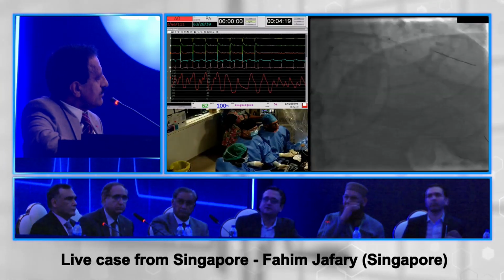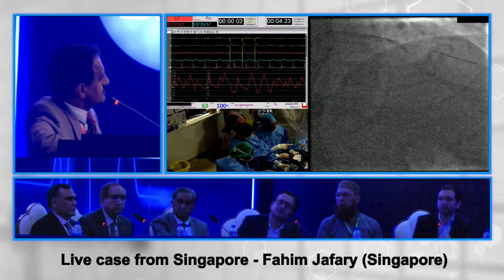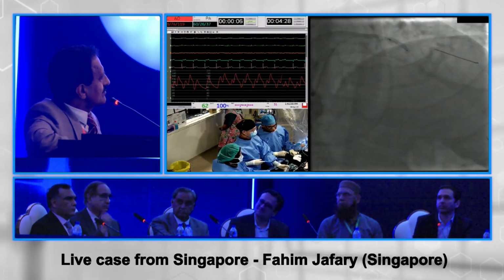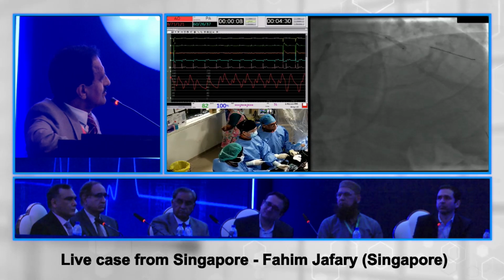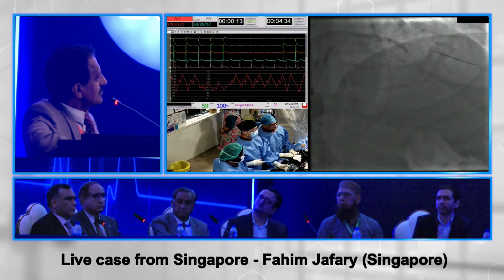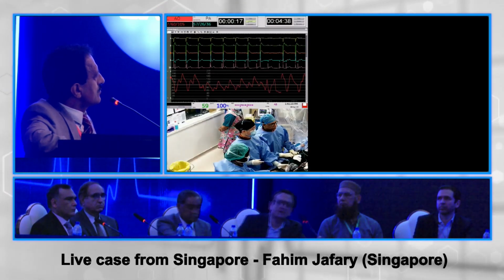Ashok, would you try a cutting balloon before going to OPN if you don't have IVL? Not at all. I think it's a fairly pathetic device. For my practice, it's only for mild to, at the most, moderate calcification, not unyielding calcification at all, and it's only meant for ostial lesions, fibrotic lesions and in-stent stenosis, nothing more than that.